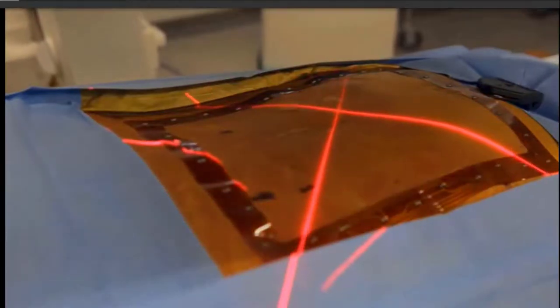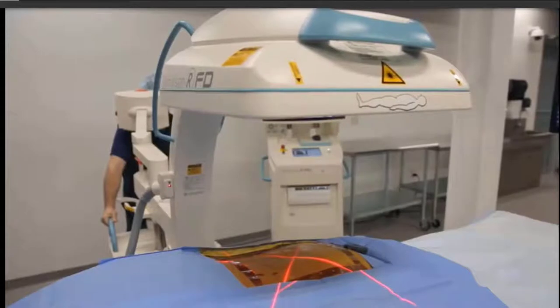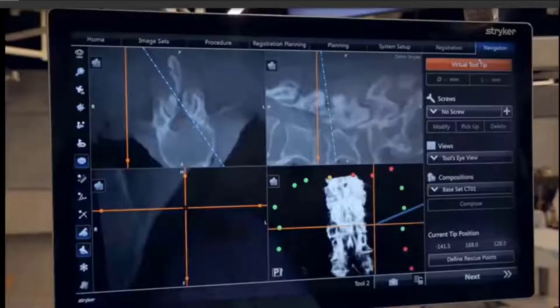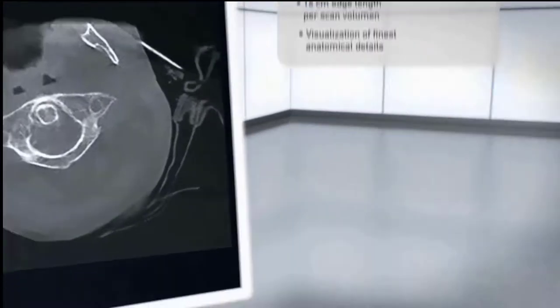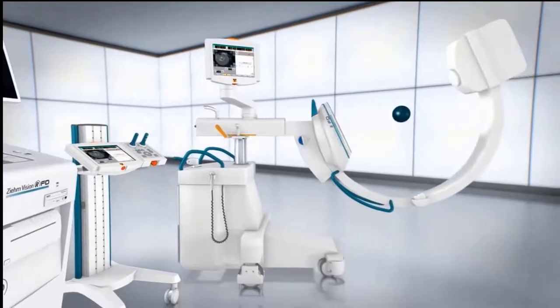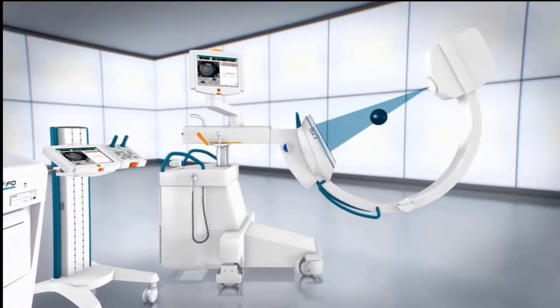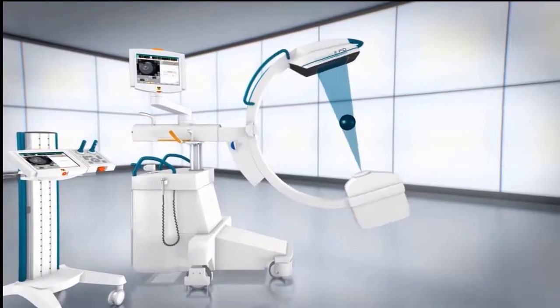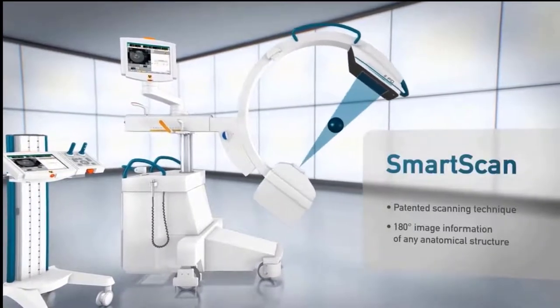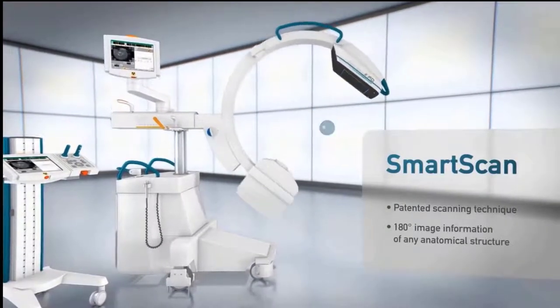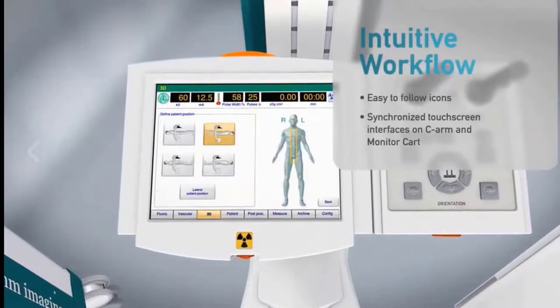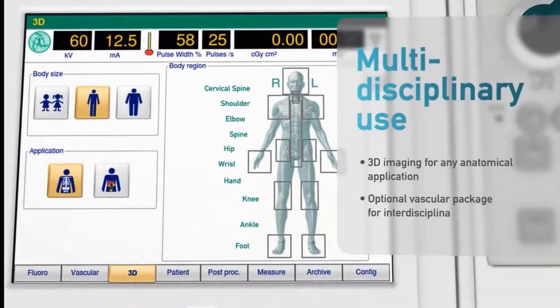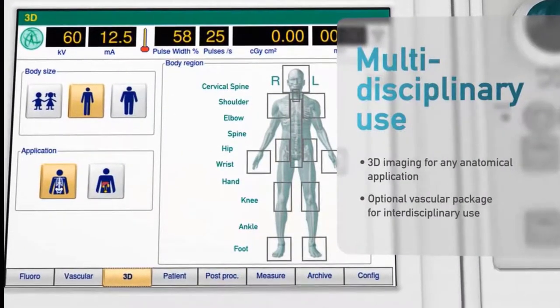This presentation is about utilizing a C-arm for 3D fluoroscopy and more. Welcome, and I hope you enjoy the presentation. This animation shows a cone beam flat panel CT acquisition of data for a 3D fluoroscopic exam. As you can see on the display, the system performs not only 3D examinations but vascular examinations and regular fluoroscopy.